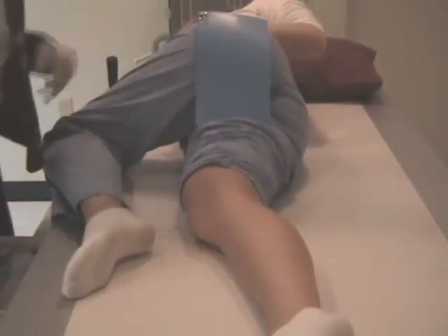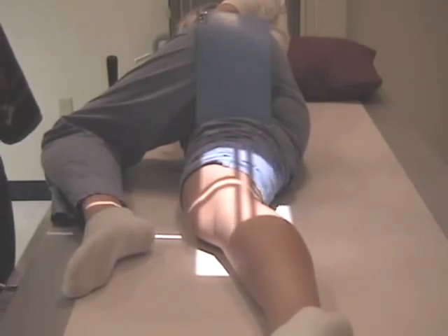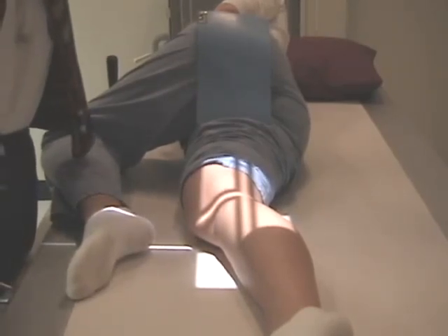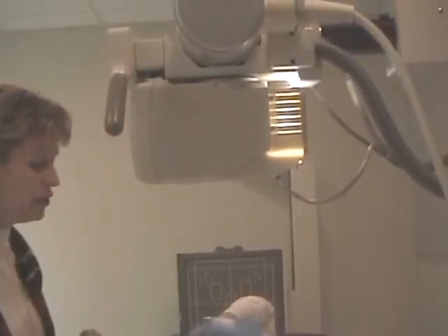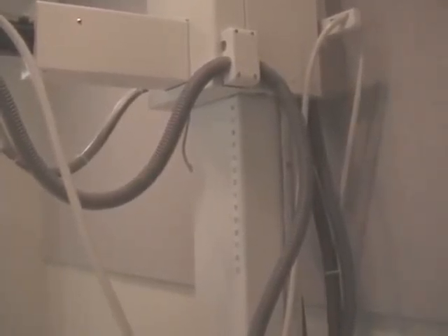Okay, now laterals, we do angle the tube routinely for all patients, 5 to 7 degrees. So I have a cephalic tube angle, 5 to 7 degrees. I'm going to adjust the gauge to maintain the 40 inches. I brought the gauge down to say 39, but it's actually a 40 SID. I'm going to want to float the table. Okay, the table won't float anymore, so I need to have you scoot back just a little bit.